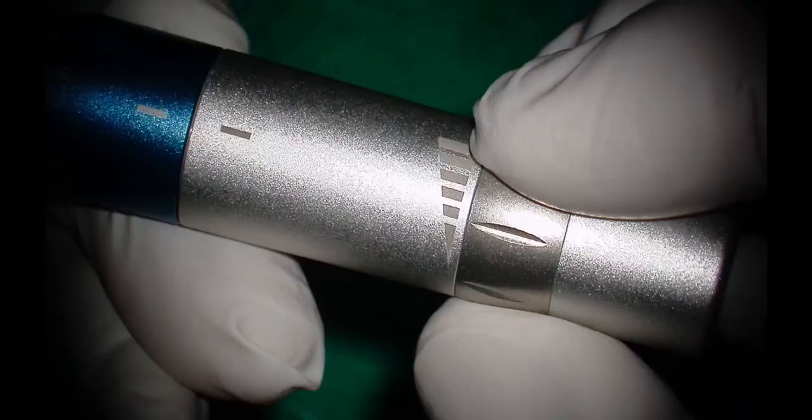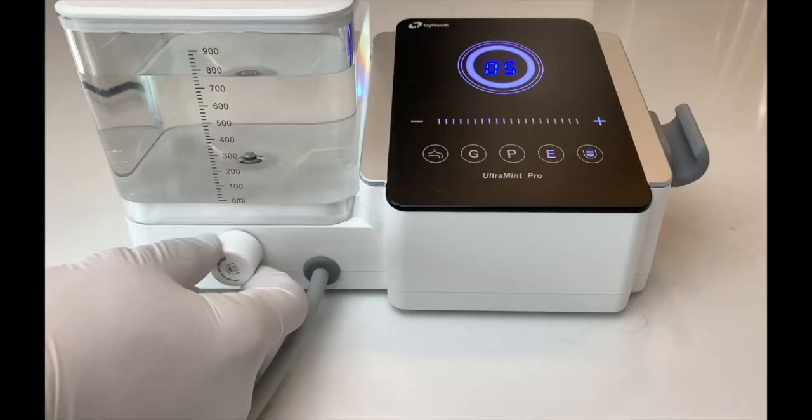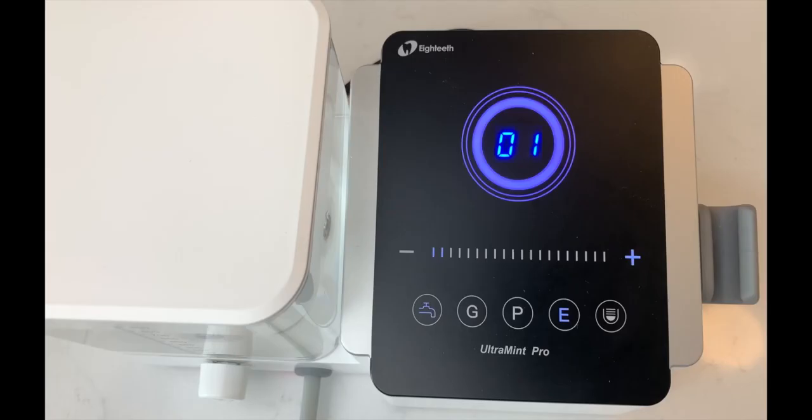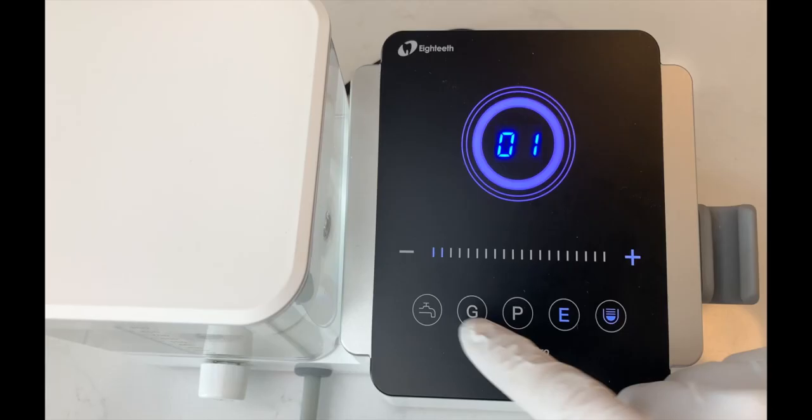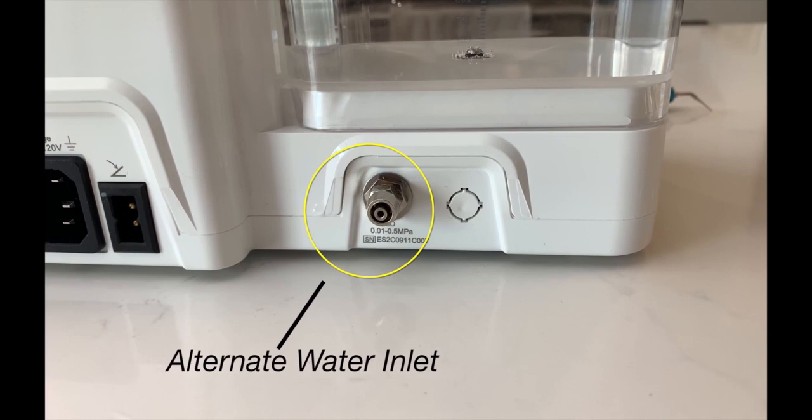Water flow can be adjusted either on the handpiece or on the unit itself. The Ultramint Pro has an integrated 900 milliliter water supply; however, you can choose to plumb in the water from an alternate source if you want to.